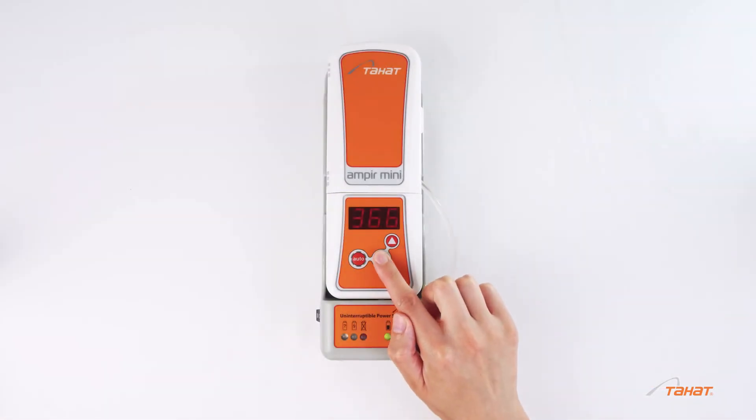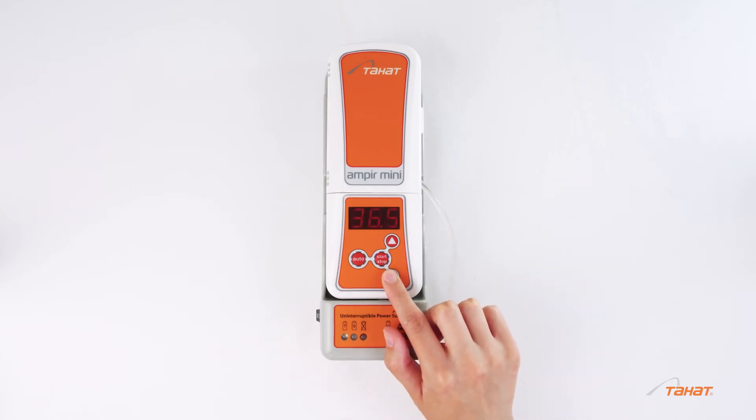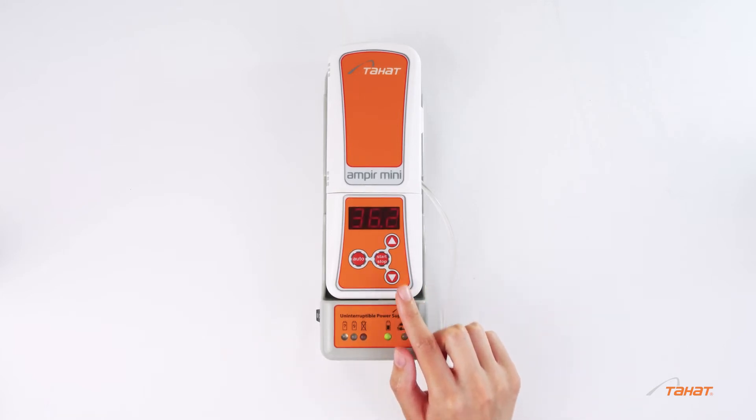For changing the temperature or mode, press the start, stop, or auto button. Change the temperature and confirm the mode of operation.